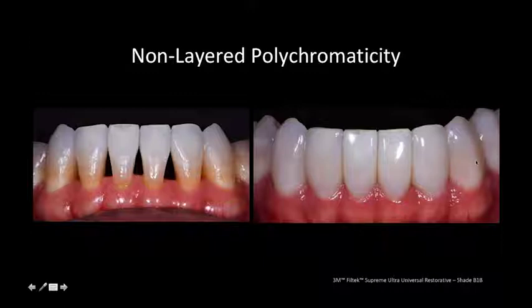Actually, even a little bit more on those cuspids, because cuspids naturally have a little bit more chroma anyway, just to help with allowing a little bit of a sense of polychromaticity to make these restorations look a little bit more, I guess, natural.